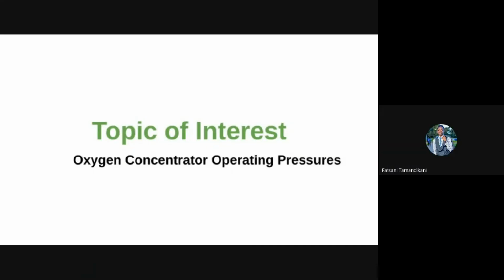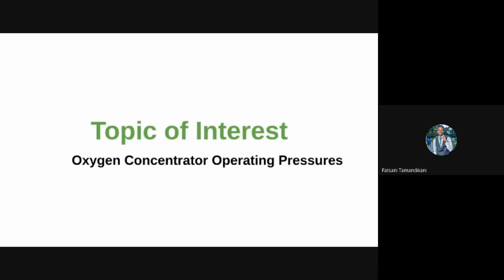Thank you, Sharon. So in today's topic of interest, we're going to look into operating pressures for oxygen concentrators. If you have been faithfully attending concentrator talks, by now I'm very sure that you know that oxygen concentrators operate under a principle called pressure swing adsorption. In this process, nitrogen is separated from the air under pressure in order to have concentrated oxygen. More details on the PSA process can be found in the topic of interest that was done on the 6th of October, and the video can be found on the YouTube Oxygen Alliance channel.